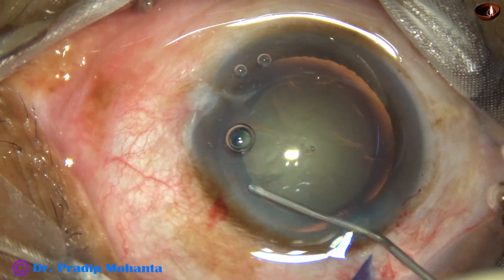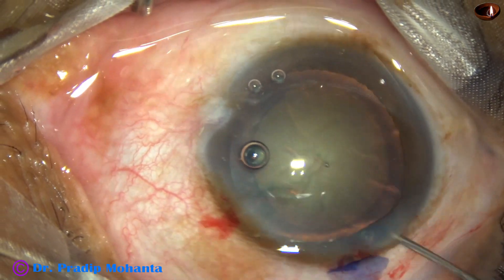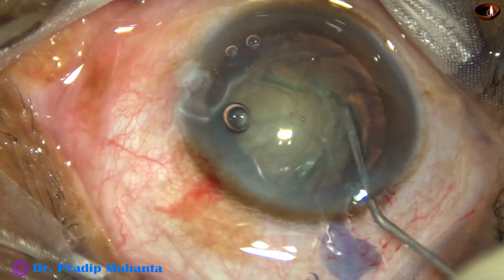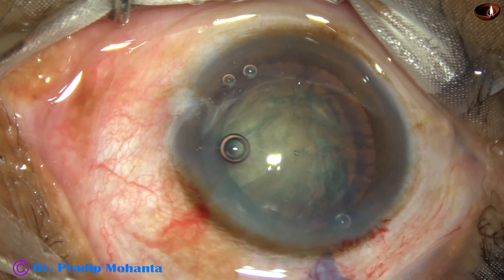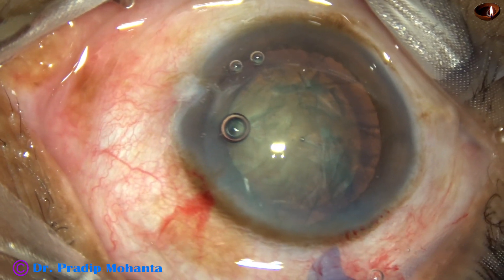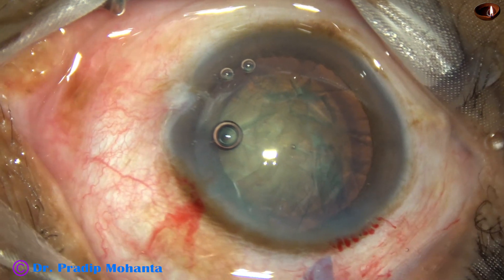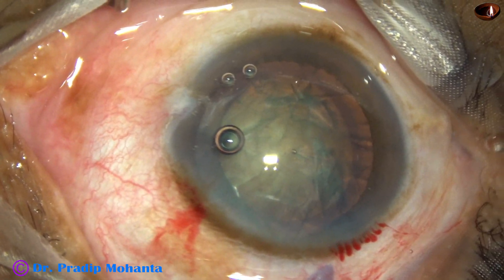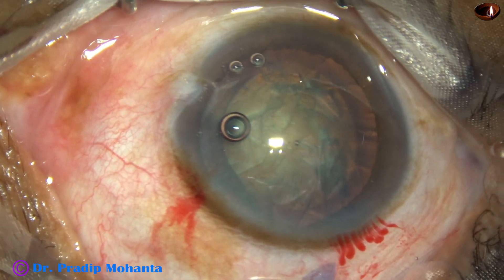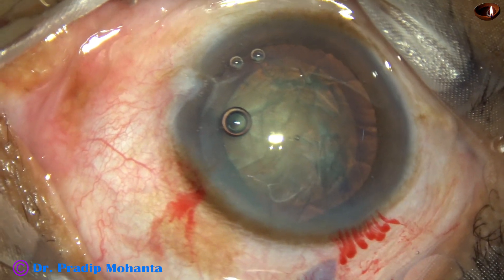Hydrodissection is done with a 27-gauge cannula and BSS. The nucleus is tapped and rotated. The anterior chamber is filled up again with 2% hydroxypropylmethylcellulose. And now, watch the Stop and Chop technique of phacosurgery.